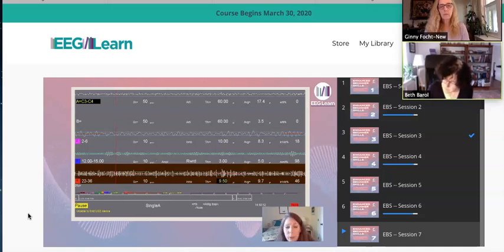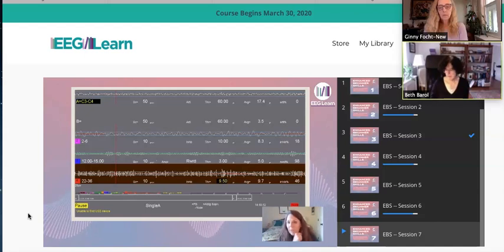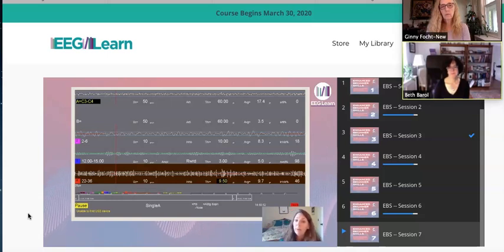Because again, with the 22 to 36, you only need a difference of 5 or 6. This person has a difference of 9.7 microvolts. So that's going to be where I set my toughest threshold, and the other ones I'm going to make easier. And then the whole point of this training is to let go, trust, allow it to happen.